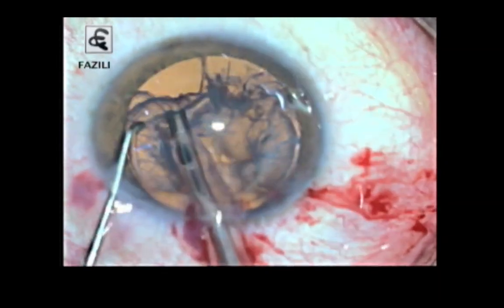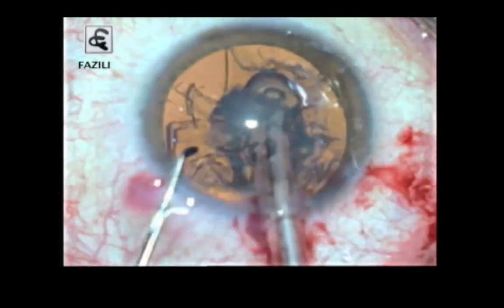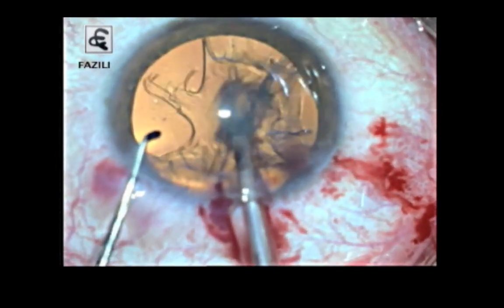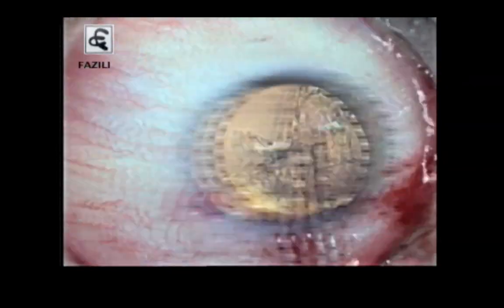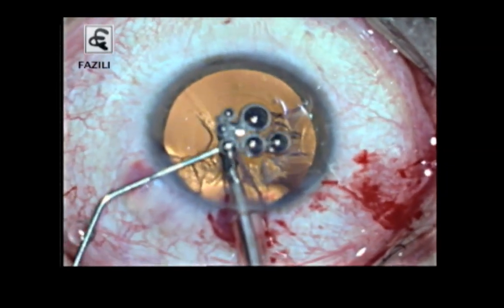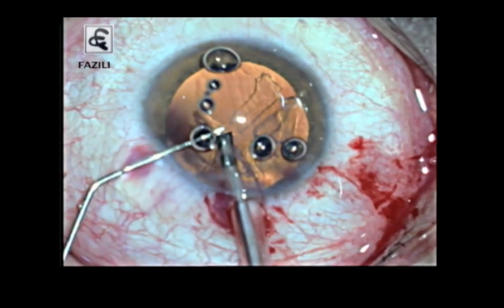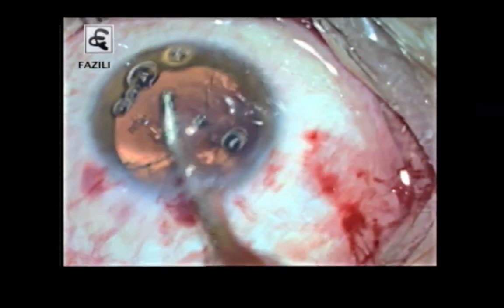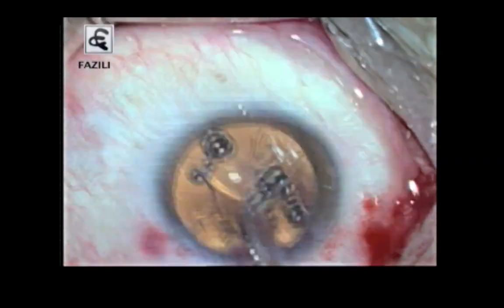Here you can see again another case where this time I'm removing the epinucleus. You also have to understand a big bag means sometimes the capsule might not be that taut. It can be a little floppy. Before I come out, again I'm putting some viscoelastic through the side port and then coming out with the same idea, reducing the fluctuation. Again, demonstrating to you finishing of the IA.